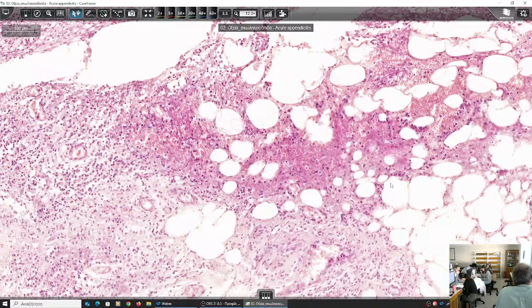So, when we have the inflammatory infiltrate going down throughout the bowel, and if it erodes the serosa, what is the serosa? It's the one layer of the peritoneum covering the organs of the bowel. If it breaks the serosa, where will the inflammatory exudate be spilled? Throughout the peritoneal cavity, and we will have the complication of acute peritonitis.